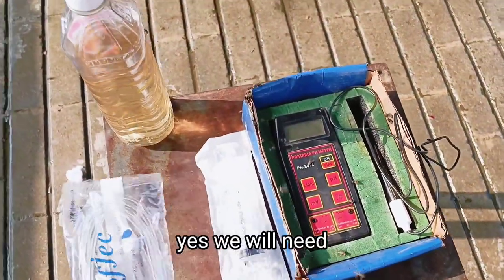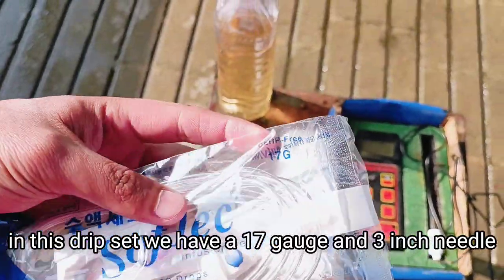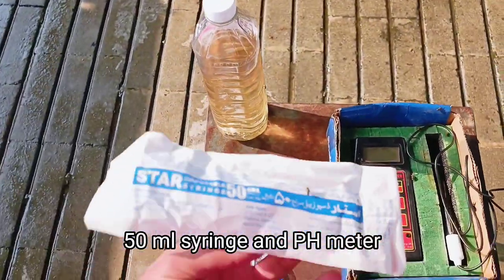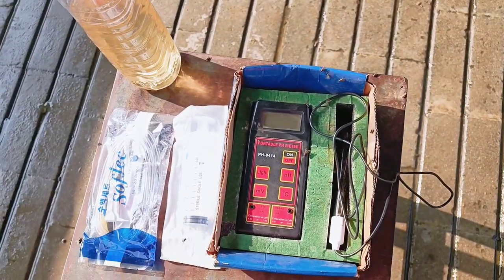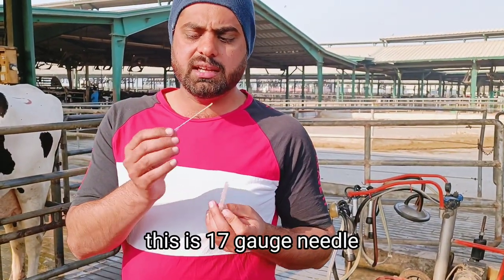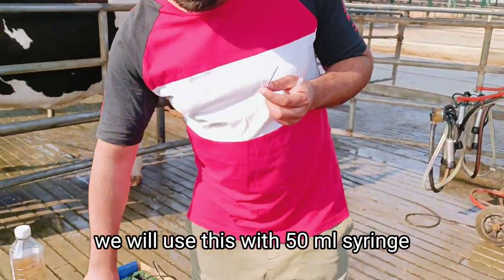We will need this drip set. In this drip set we have a 17-gauge and 3-inch needle. We have a separate 50ml syringe and a pH meter. This 17-gauge needle we will use with the 50ml syringe to draw rumen fluid from the rumen.